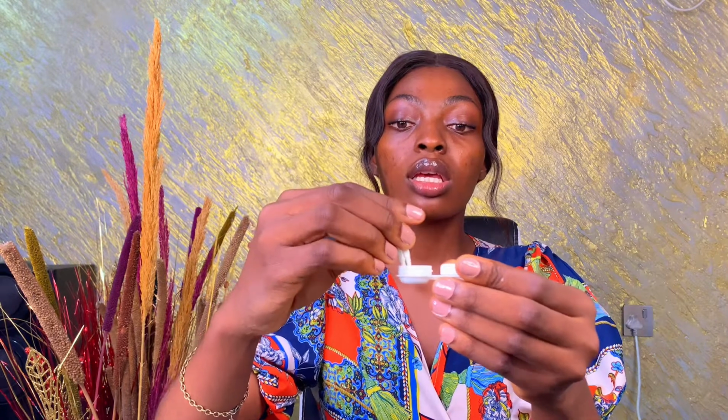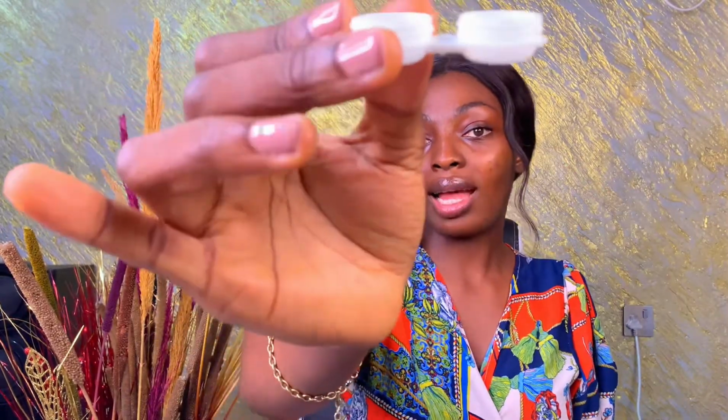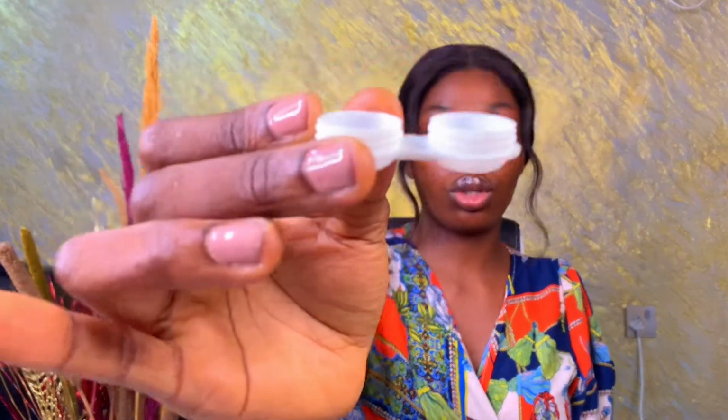So what you do is you open the first one. I think I'm starting with the right. You open it and then you pick your tweezers. We have this tool inside the tweezers, and then you take the lens out like this. You want to raise the lid and drop it in the lid. So this is it, and you do the same for the left one. You want to open it, take it out, and then you drop it in. I'll just go now and dispose of this solution.